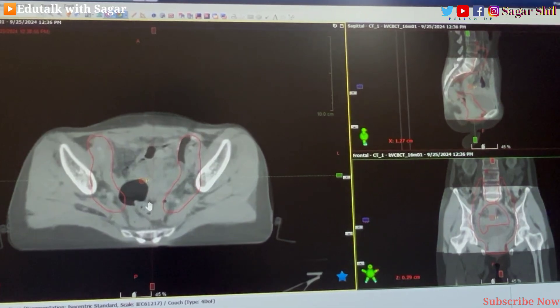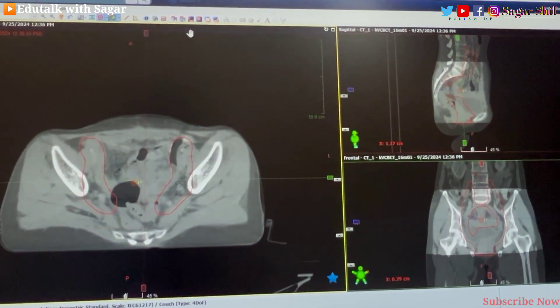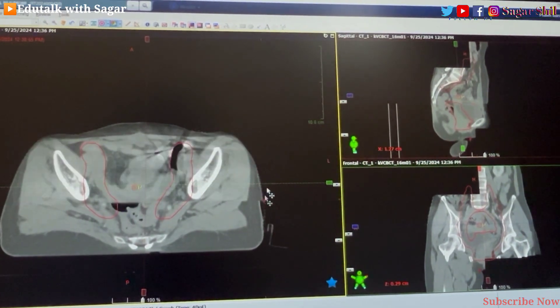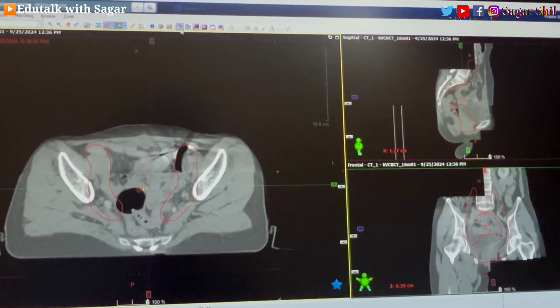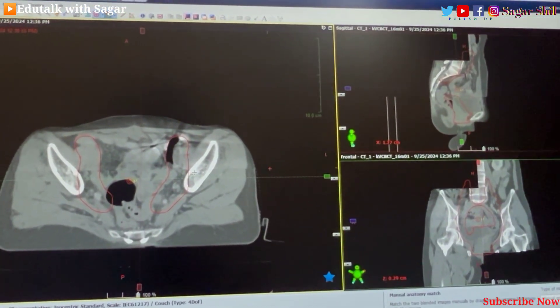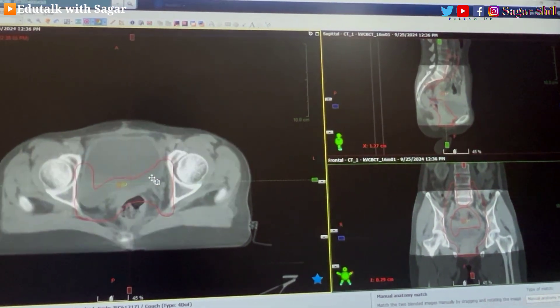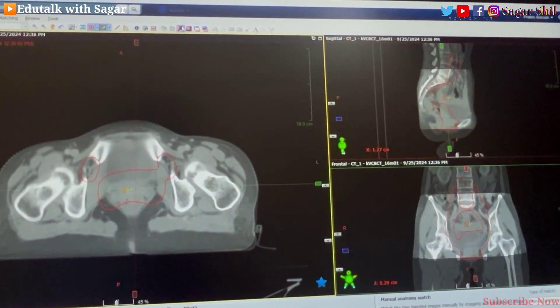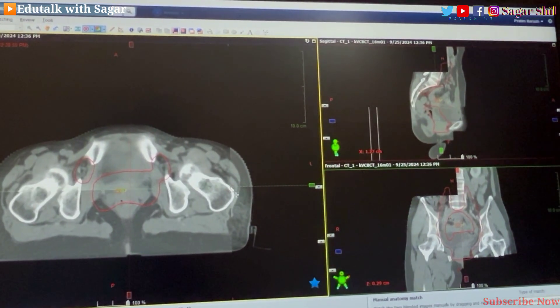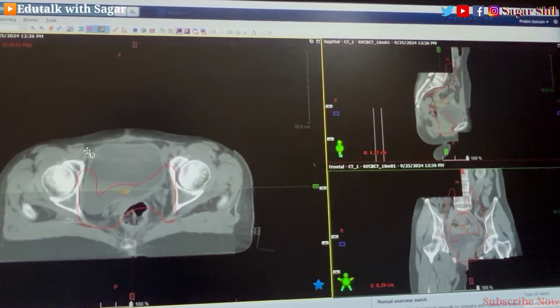The system will automatically fuse the images — fusion will be automatic. I am using a split window so you can see the variation. First you can match using the bone landmarks. There is a little variation you can see in the bone ends. With the help of the hip bone and femoral head, and also with the help of the coccyx, you can match this.